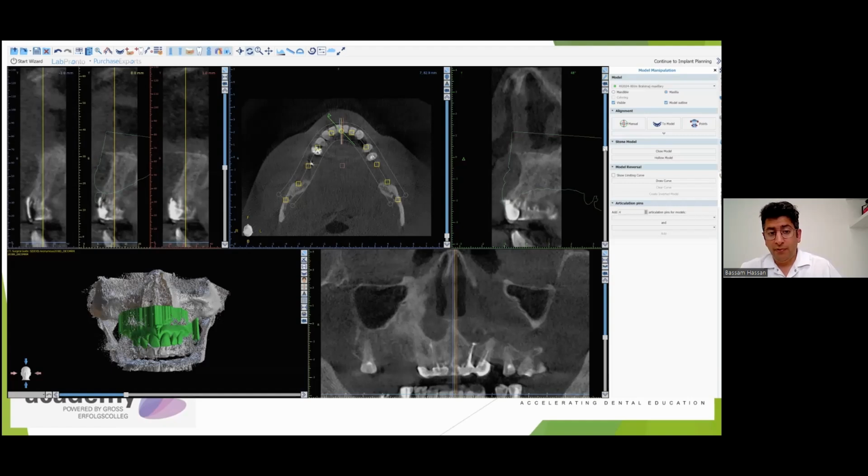What does that mean? It means this scan was probably done with an extended scan setting, maybe 25, 30 seconds, in which the patient had the possibility to move, and then the software tried to adjust for the motion by doing motion correction. Maybe the signal to noise ratio is very poor.